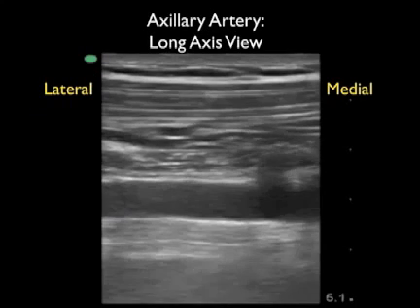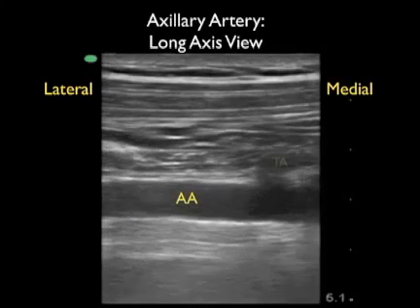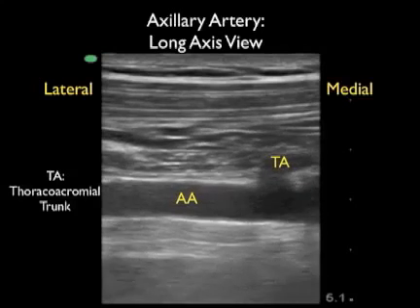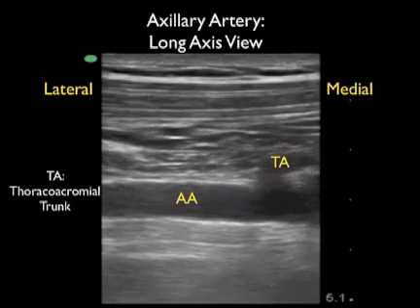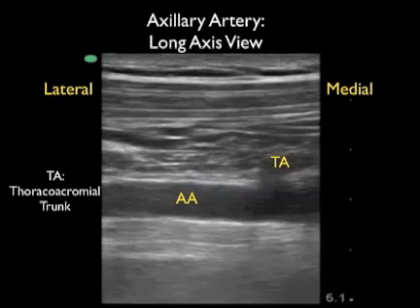Now let's take a look at the axillary artery using B-mode or grayscale sonography. We can see the axillary artery arching from lateral to medial across the patient's chest wall, and we note the pulsations within the lumen indicative of an arterial structure. We can also see the thoracoacromial trunk coming off medially off the axillary artery.